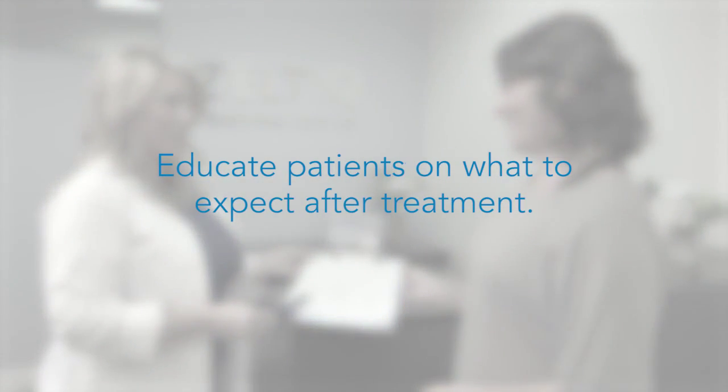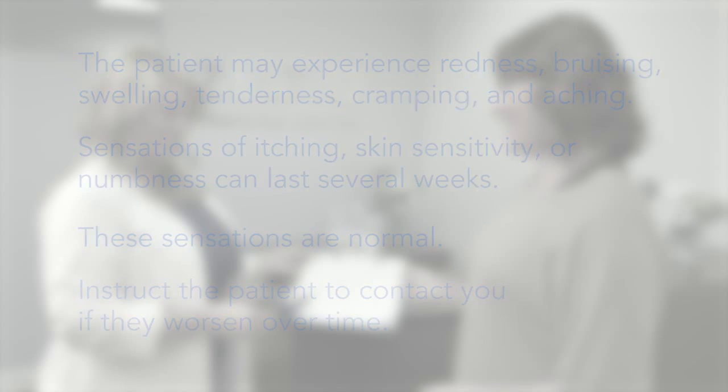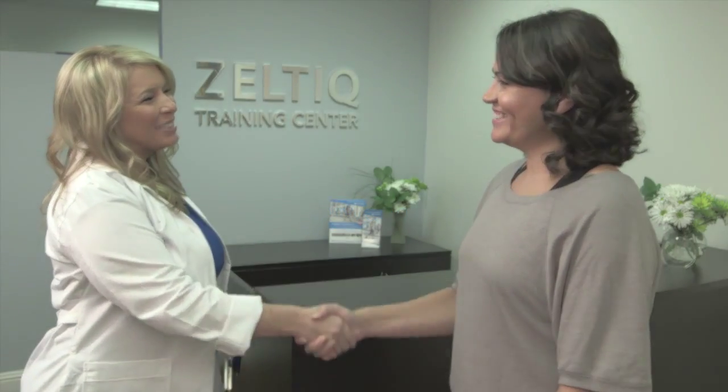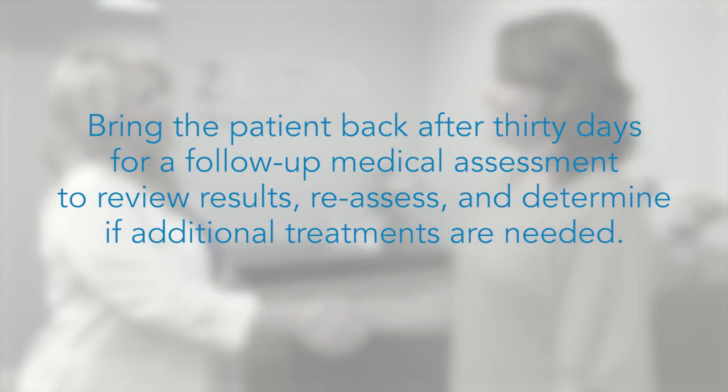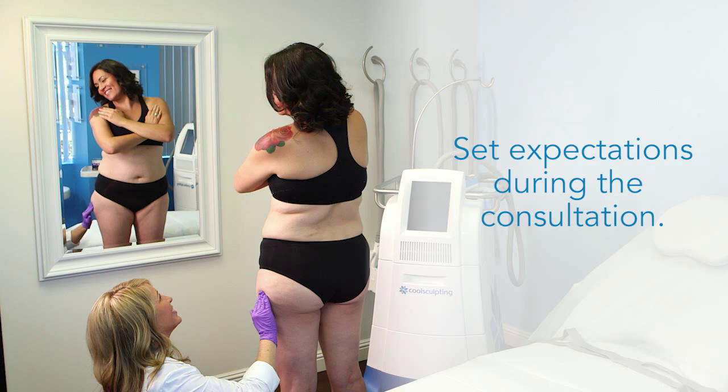Educate patients on what to expect after treatment. In the days and weeks following treatment, the patient may experience redness, bruising, swelling, tenderness, cramping, and aching. Sensations of itching, skin sensitivity, or numbness can last several weeks after treatment. These sensations are normal, but instruct your patient to contact you if they worsen over time. Patients may begin to see results in as early as three weeks, but will experience the most dramatic results between one and three months. Bring the patient back after 30 days for a follow-up medical assessment to review results, reassess, and determine if additional treatments are needed. Treatment of the outer thigh may take more than one treatment session, so set expectations with your patient.